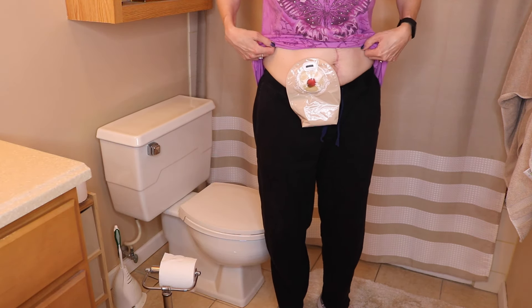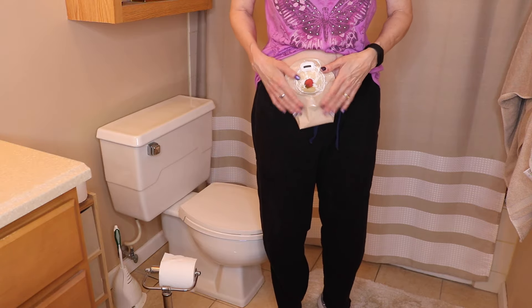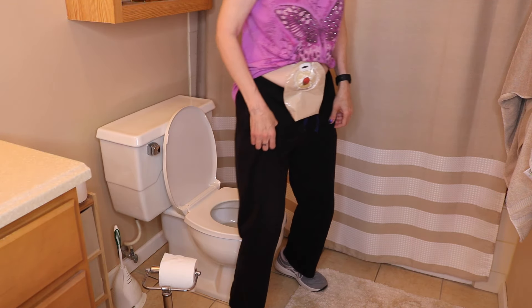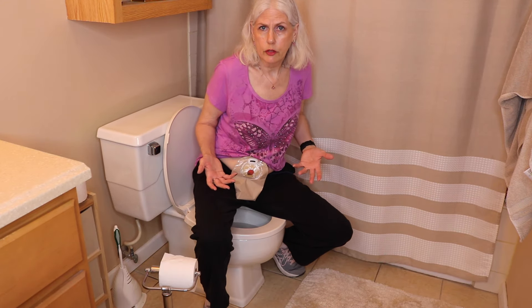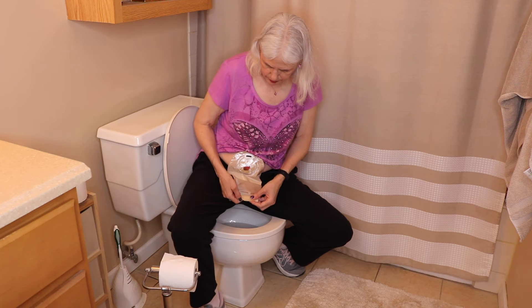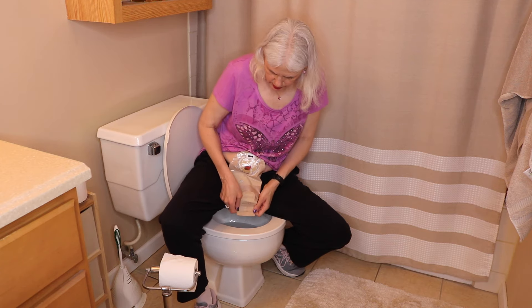So there's my bag — all nice and clean. One of the ways of draining a bag is just sitting on the toilet. You can sit fully clothed if you don't feel like you have to go to the bathroom. Then obviously I'll just undo my bag, undo my velcro, unroll it.